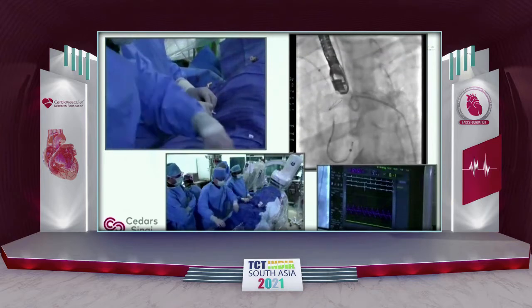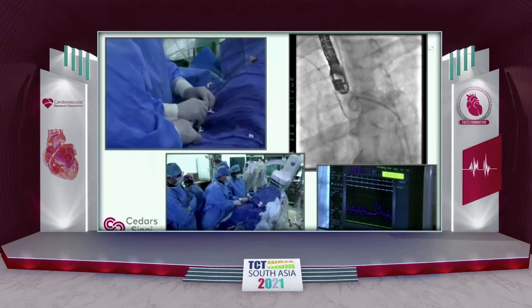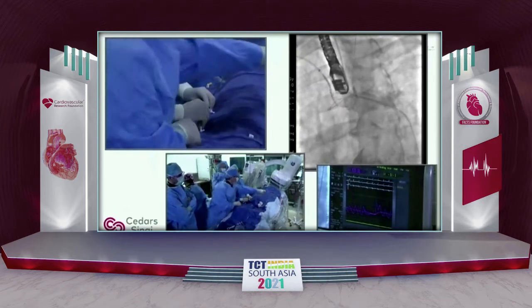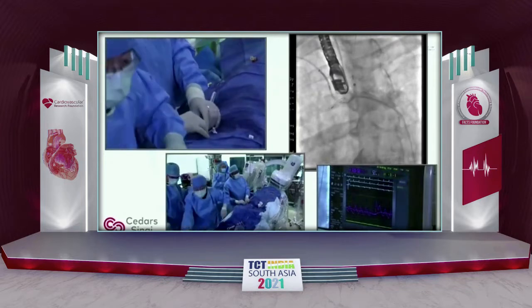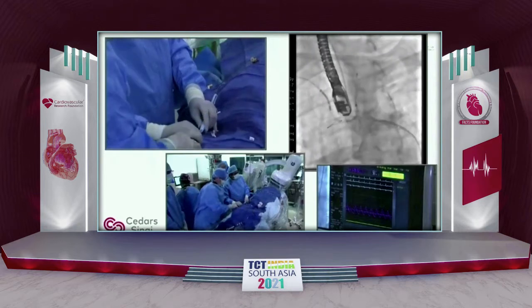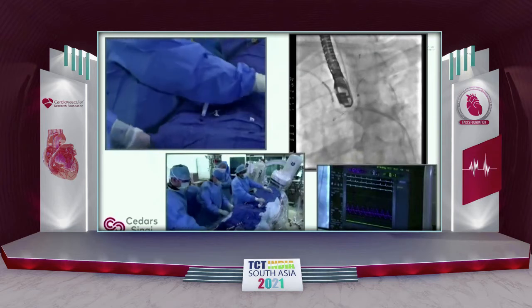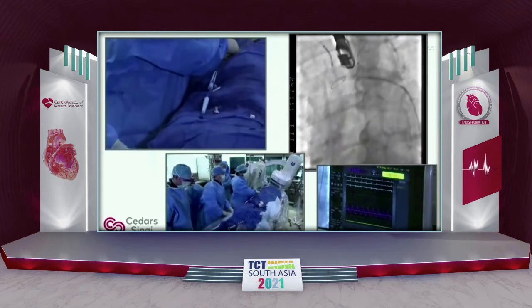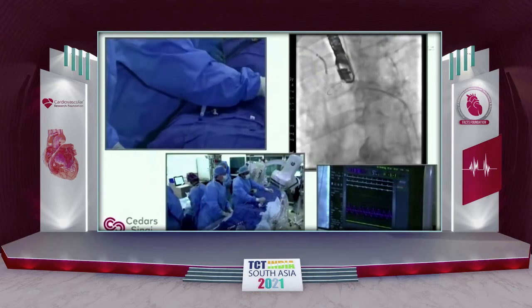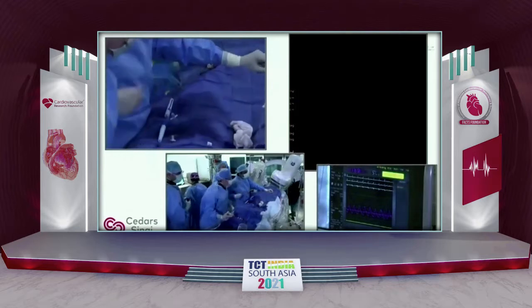So I think that both of these strategies are fine. It all depends upon what you can adapt to your place. Okay, so you saw that we deployed the first filter, we deployed the second filter, and I'm now going to advance this. Okay, so we are up in the carotid, and now we're going to deploy. All right. So I think it's very clear, and I'm going to pull it back gently so that it's flush, okay? So go ahead and let's take a picture and show this.